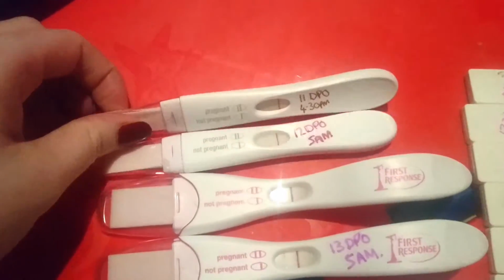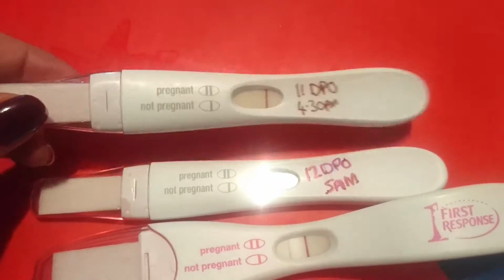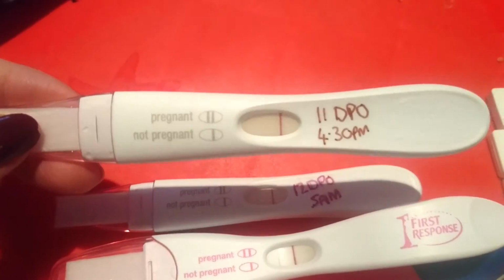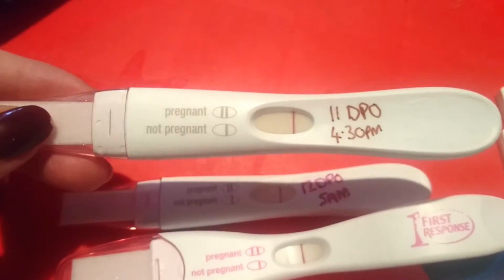So like I said, we used the First Response. You saw us take this one in our live pregnancy test video. You can just see it on there. It was very, very faint. My husband couldn't even see it. I think possibly he might need glasses.